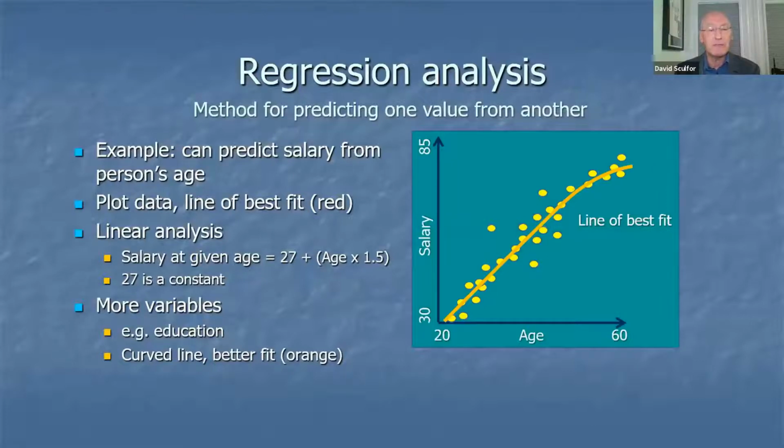And in fact, you can put some numbers on it for patients. If you know what your figures are, you might be able to say to the patient that you've got an 85 to 90% chance of not needing glasses for distance and just needing them for reading. But of course, the corollary to that is they've got about a 10 to 15% chance that they will need glasses for distance. And of course, there's no way of predicting who those patients are going to be, except you can guarantee it will be the most difficult patient of the day.